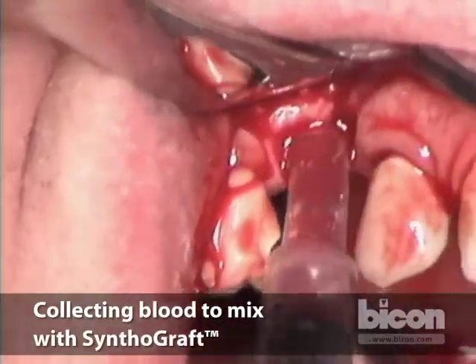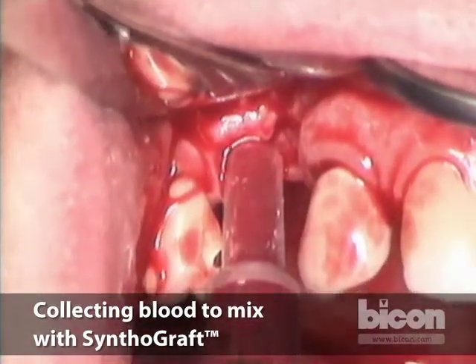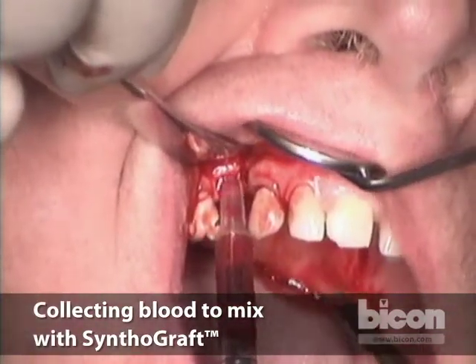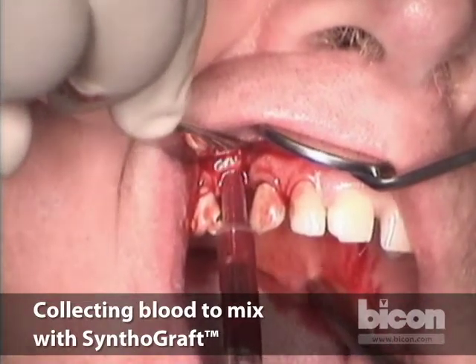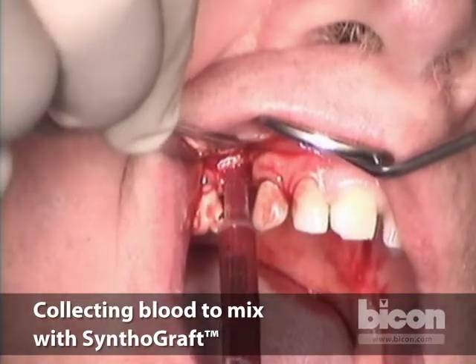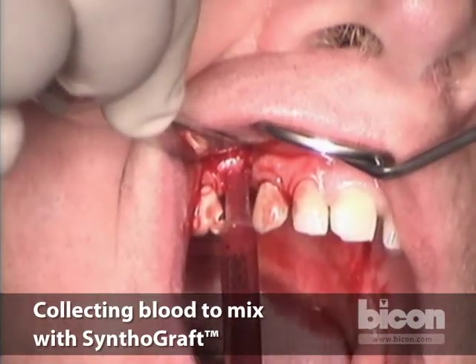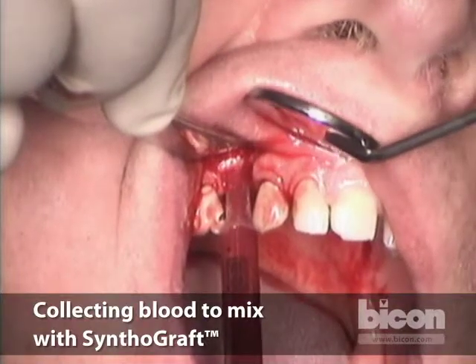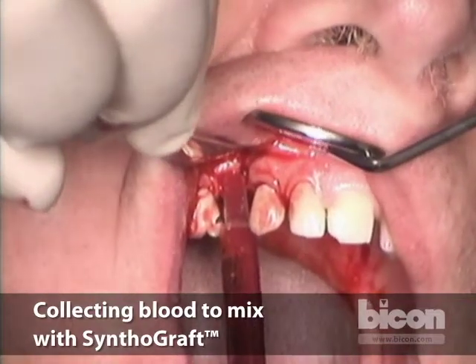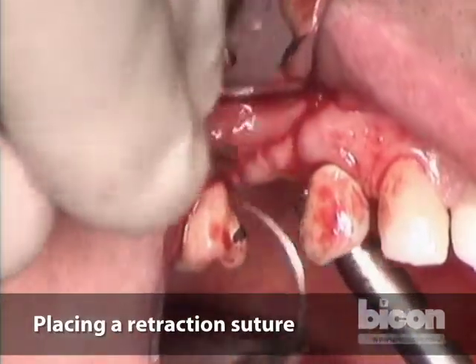Now, since we're anticipating the use of SynthoGraft, we will collect some of the blood and save it, set it aside to use with the graft itself. So we don't need to do anything fancy. All we need is some of the blood, even if it congeals and clots, we will break the clot with the graft. So all we need is about half a cc. We set that aside. So we have this flap.